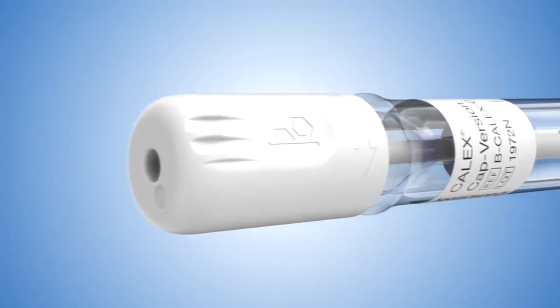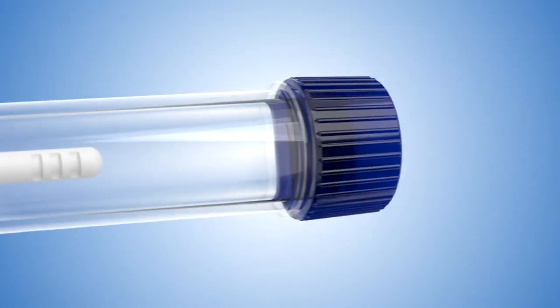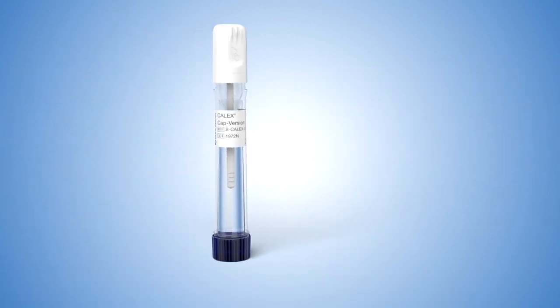Today I'm going to show you how to do a stool preparation with the CALEX Cap device, currently to be used for testing on the Buhlmann FCAL Turbo and/or fPELA Turbo assay. This video is meant to function as a training tool to review the details and highlight some of the important nuances to performing a stool collection.